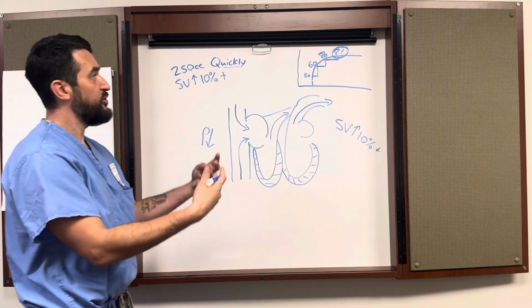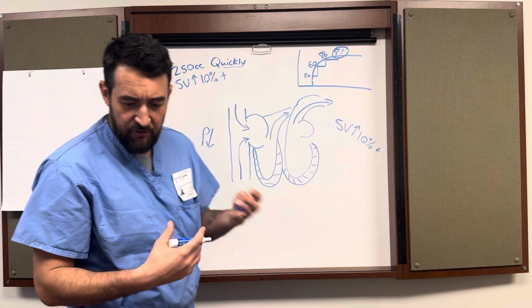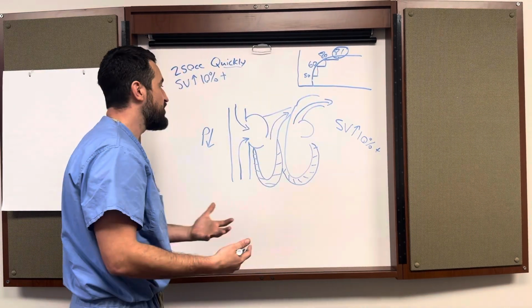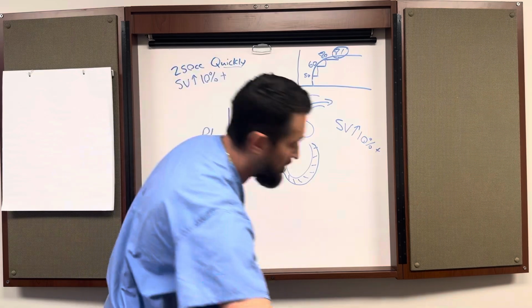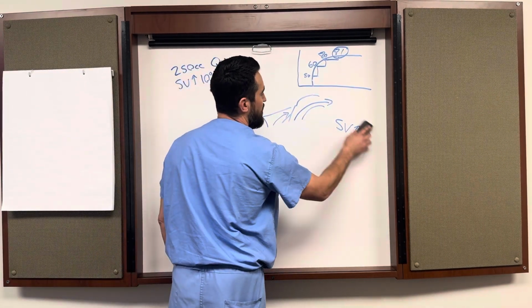And so giving more fluid at this moment is not gonna help my patient. So this is a really great safety mechanism to help us prevent fluid overload in our patients. It also helps us to extend the usefulness of each bolus.